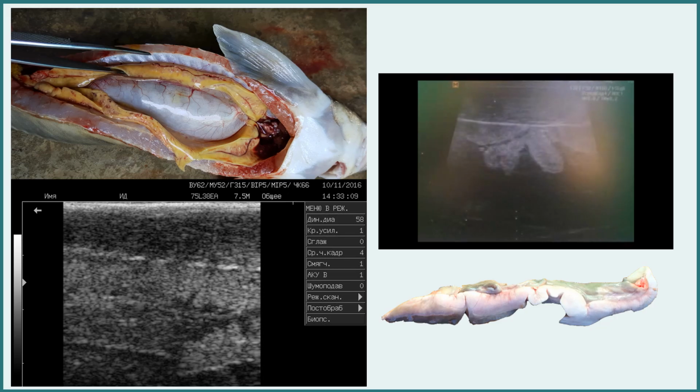And we proceed to the principles of gonadal capture. Let us immediately agree that at this stage we do not consider fish with gonads of the beginning of the second stage, and even more so the transition from the first to the second stage. It is practically impossible to start mastering diagnostics at these stages, and besides, it makes no practical sense.